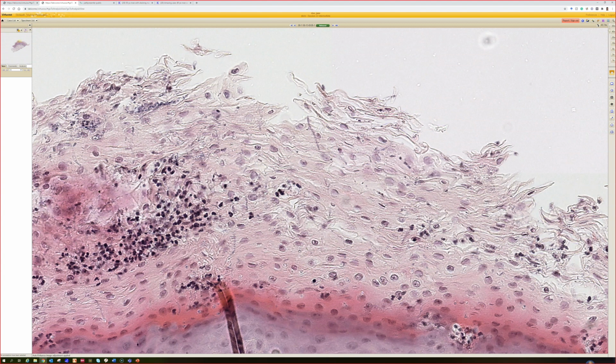And I actually found out not long ago from reading in the literature that Candida can actually produce true hyphae in addition to pseudohyphae. Some mycologists will have to explain to me how you actually make that distinction, like what the technical definition is. But I feel like on light microscopy, I cannot recognize the difference between those. I can, however, think of some clues for candidiasis. One, like you said, is that the hyphae don't always, but they tend to be vertical, north and south. They dive down into the epidermis, whereas dermatophytes kind of surf along the waves, okay?